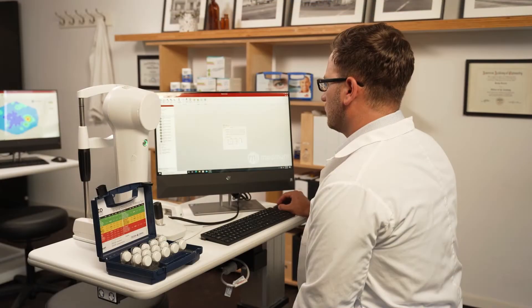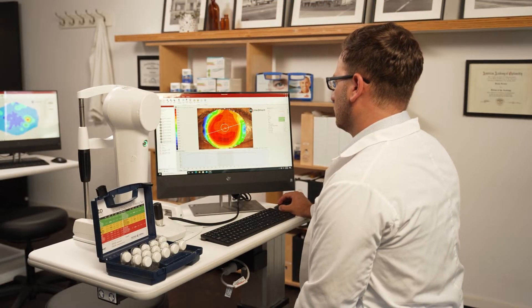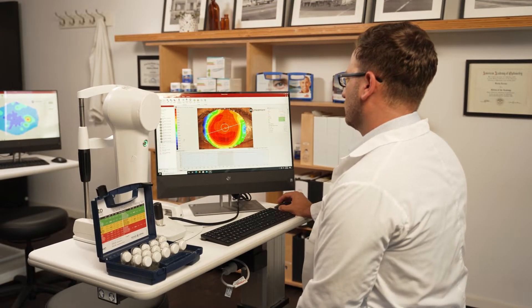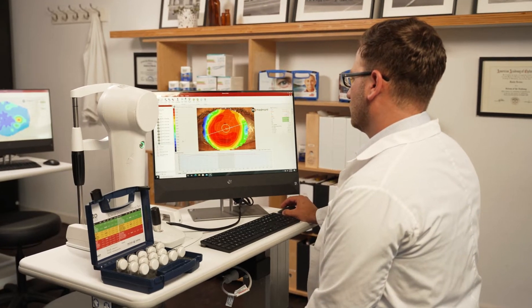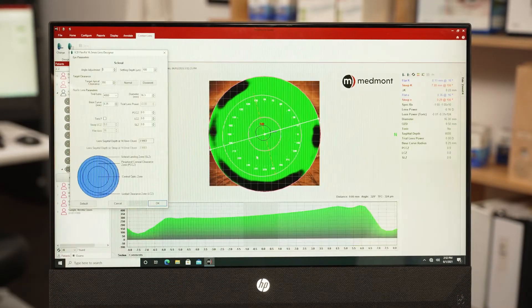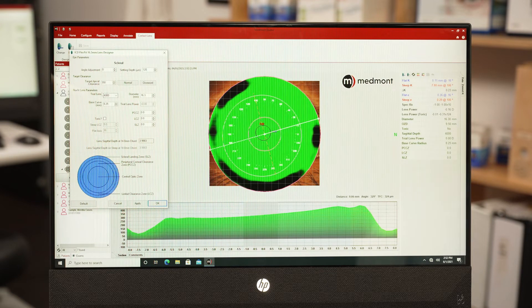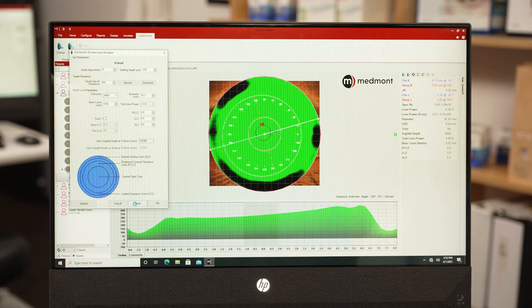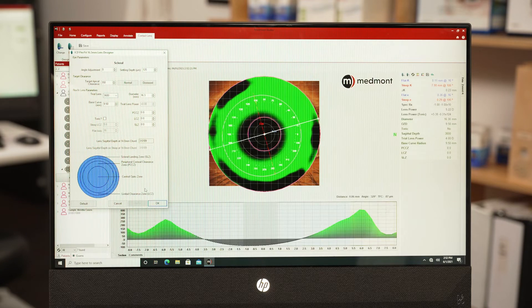The contact lens software is one of those unique features of the Medmont that allows you to build your specialty contact lenses from the topographies. You can construct your corneal GP, single vision, and multifocal lenses, your ortho-K scleral, and many other specialty lenses for your patients.